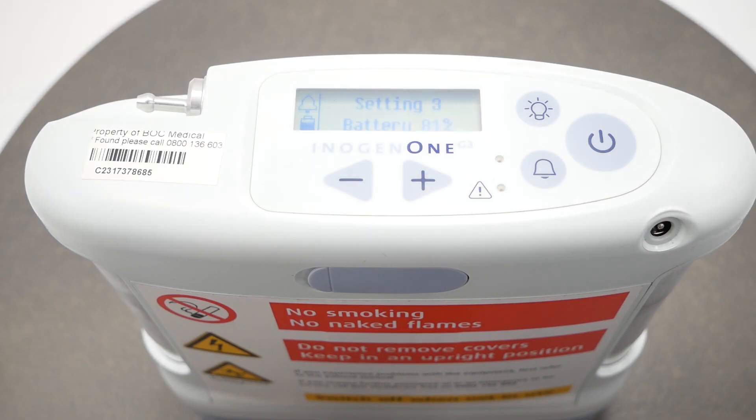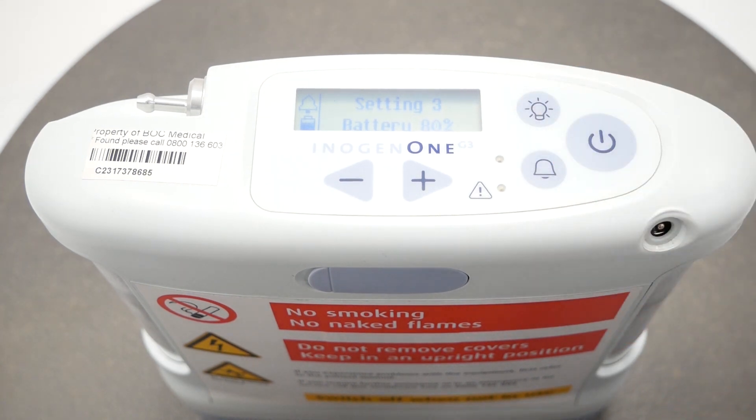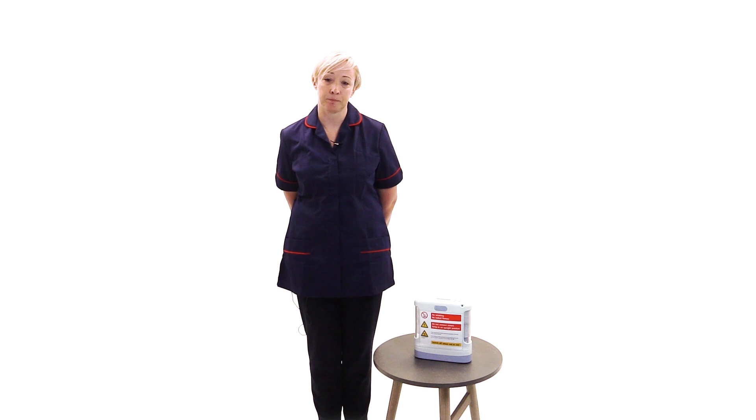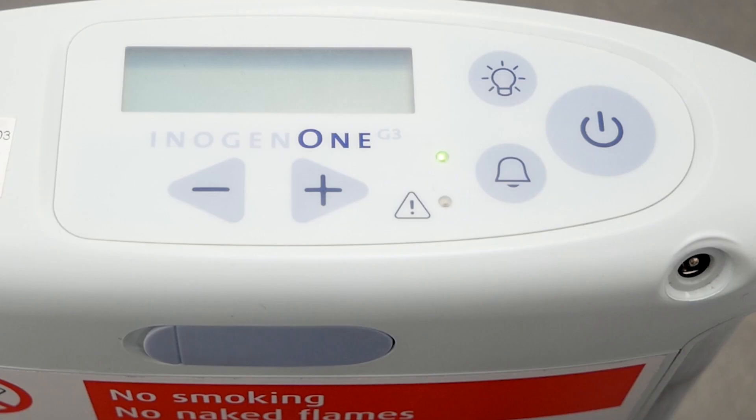The display backlight button. If you push this button it turns on the display backlight for better illumination of the device settings. The backlight turns off automatically after 10 seconds. The display screen shows information regarding the flow setting, power status, battery life and errors.